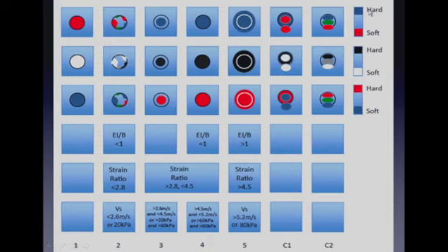But what I've done is some manufacturers have blue as hard and some manufacturers have red as hard, and you're actually on almost all these machines able to change to whichever color scale you like. And again, I really like to use the black and white scale because I believe I can do my measurements much better. But I will mention that if you are going to use the black and white scale, you need to make sure that you're only showing the elastography data on the elastogram. So you need to turn off showing the elastography information superimposed on the B-mode image. Because if you use the black and white scale and you have the B-mode image in black and white and the elastography superimposed on it, you really can't interpret those images because you have a grayscale on grayscale image, and you really have a hard time distinguishing the 2 images.